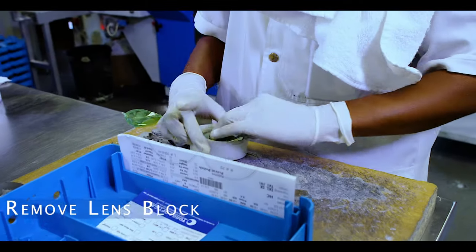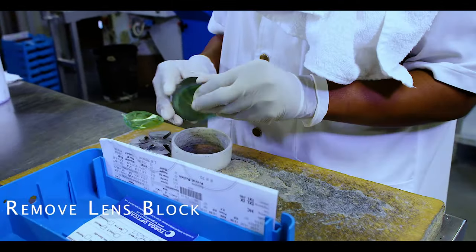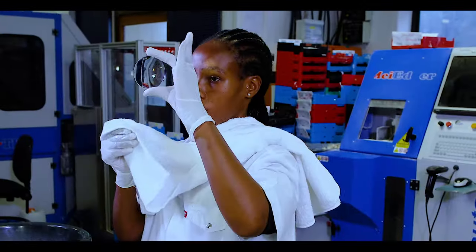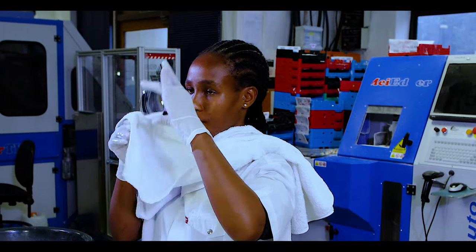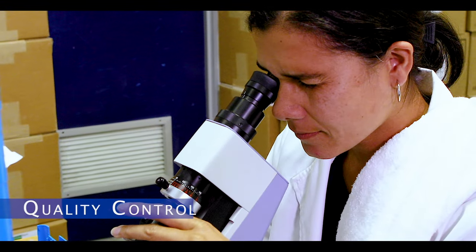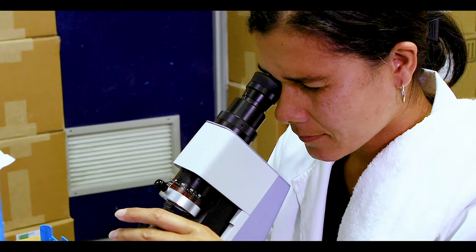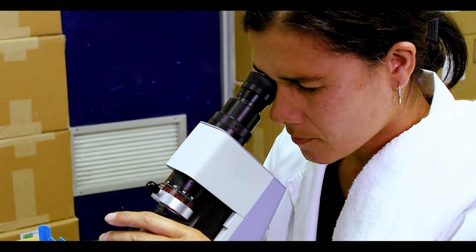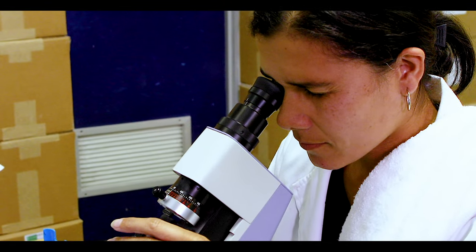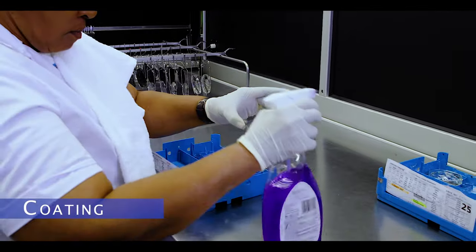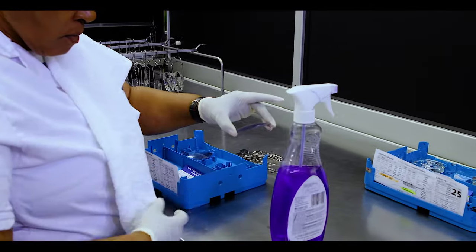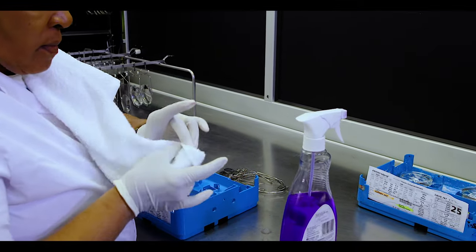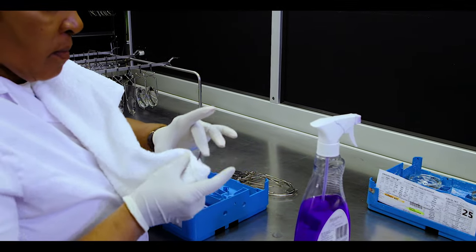The lens block is then removed and the lens is washed and inspected. Your lenses are then checked to ensure the prescription has been optimally manufactured. The lenses are once again washed by hand and manually inspected to ensure there are no flaws.